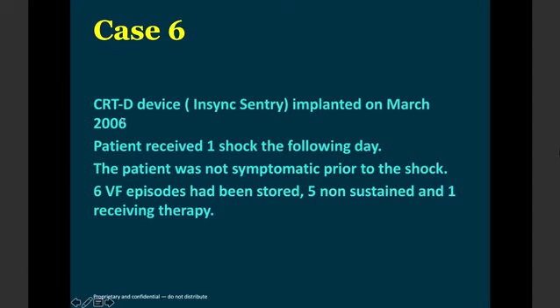There is a case number 6, a CRT defibrillator once again implanted in the year 2006. Patient received one shock the very following day. Today the patient was implanted, the next day the patient had a shock. The patient was not symptomatic prior to the shock. When you interrogated the device, you find that 6 VF episodes have been stored in the data. 5 of them fortunately were non-sustained and 1 was sustained enough to receive this shock.